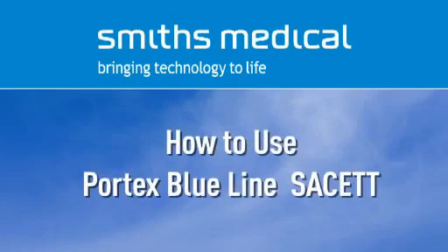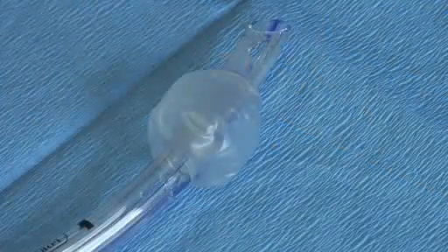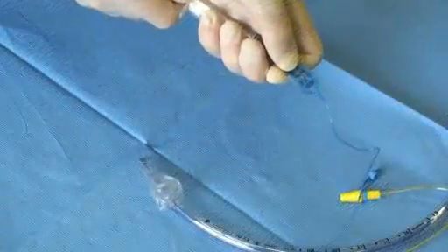How to use the SACETT. The integrity of the cuff and inflation system should be checked prior to insertion. Remove air from the cuff prior to intubation.